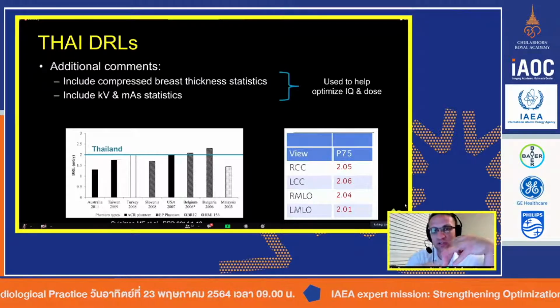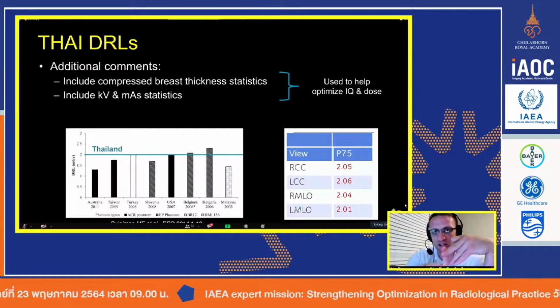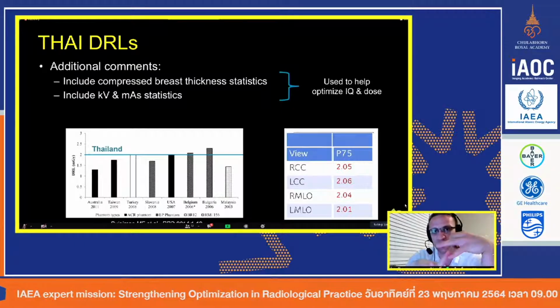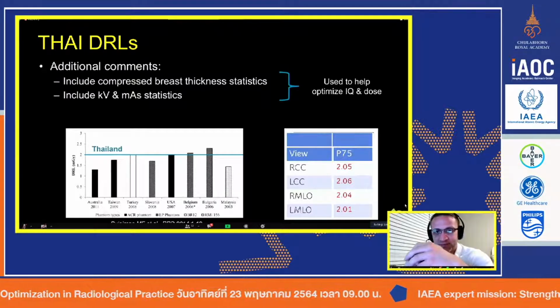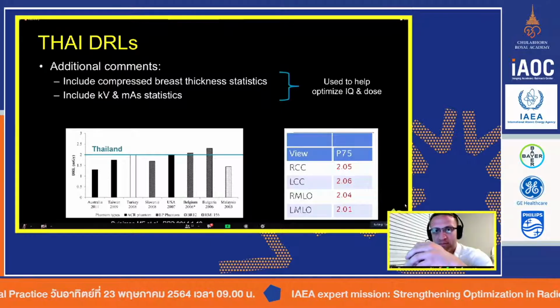I'd make sure it's an indirect detector. Obviously, make sure you get a good size field of view. And there's a bunch of other factors that you'd want to consider. But by way of dose, those two, the indirect detector and the tungsten rhodium, have really good dose reduction properties. Yeah. It's good because sometimes we just know that we like the image from this vendor.